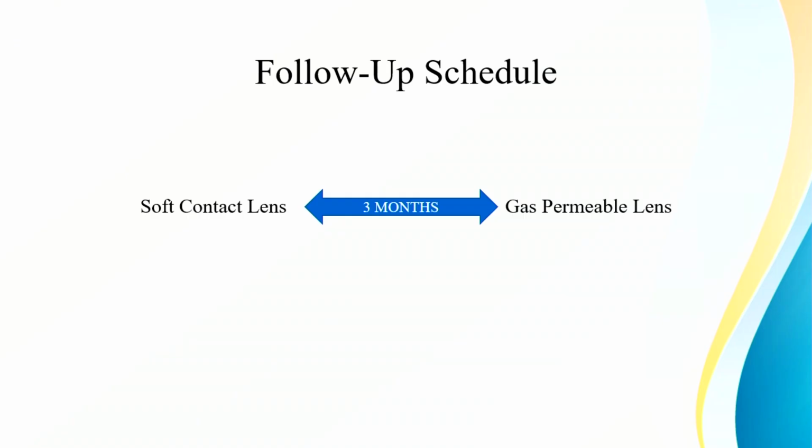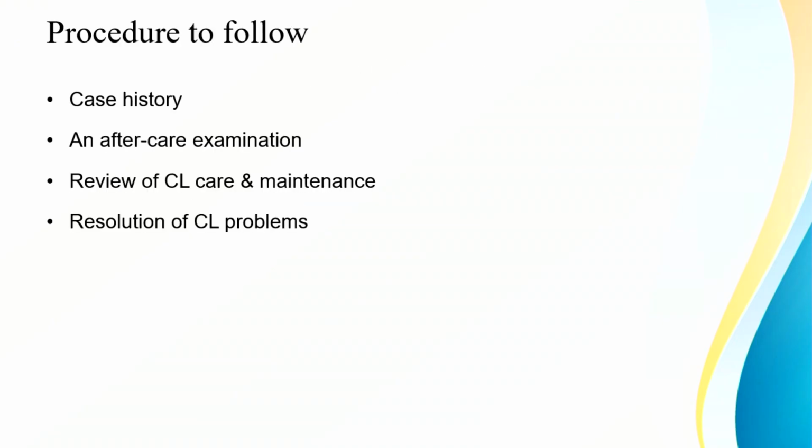Few challenging patients, you can call in 15 days. The fitting techniques are a little challenging. You can recheck in 15 days so that the prevention will be better. And for RGP, usually we call them for 3 months or 6 months. So it can be a protocol which can be maintained.